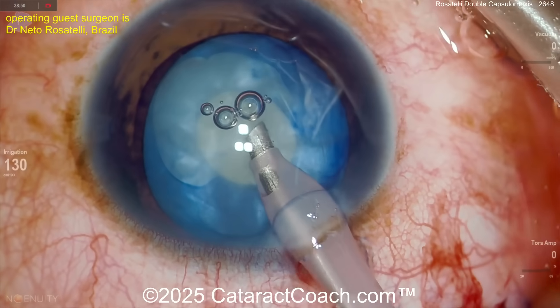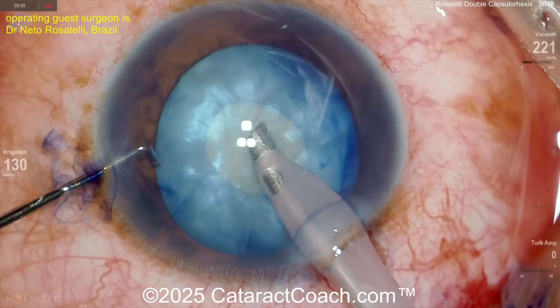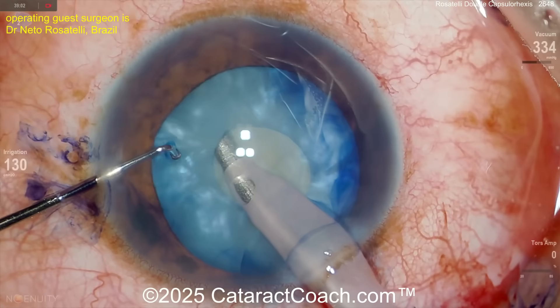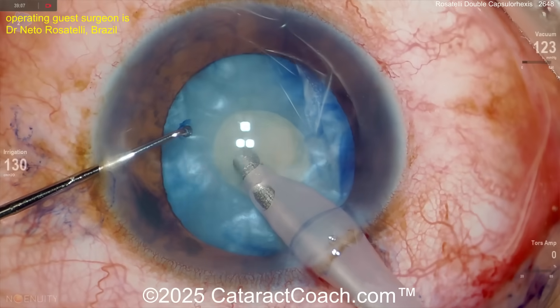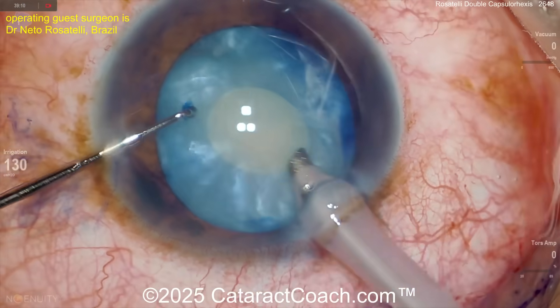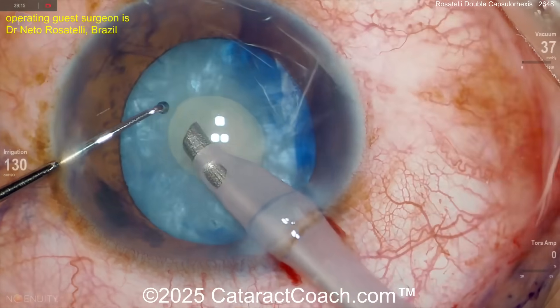To decompress it, you can rotate it, you can push on it. There's some milk coming out — see that. Netto is going to use vacuum from the phaco probe to really decompress the bag, going under that rhexis a little bit, rotating the lens, tapping on the center of it, making sure you really get all that intumescent fluid out. The milky stuff has to come out — you've got to milk this baby.